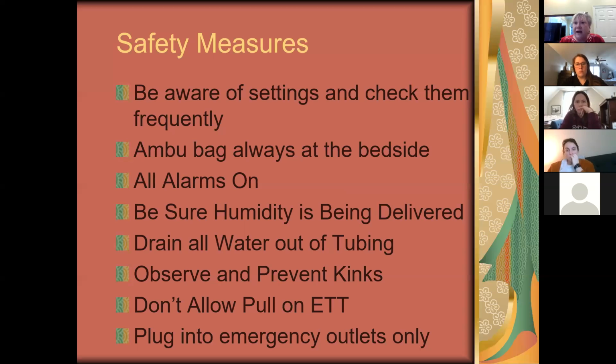If it's low pressure, find out why. Are they really being ventilated, or is there something wrong with the machine? But if you have any question, take them off and bag them until respiratory can get there. Make sure that humidity is being delivered. There should be water or some type of humidity being delivered.